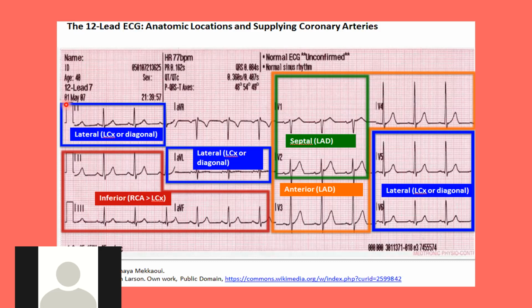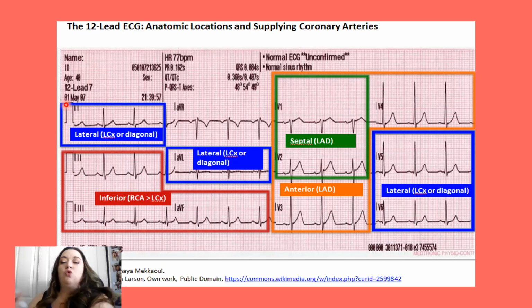So I have one other question that seems kind of stupid. Are all MIs STEMIs, or is the STEMI just a type? That's a great question. No, thank you so much. There's two ways a heart attack can show up. They can walk in the door and I physically see this ST elevation on their EKG, and that's a STEMI. And those are the ones that we can do the whole process, door to balloon time, all that, right? The other way a heart attack shows up is in what lab work?